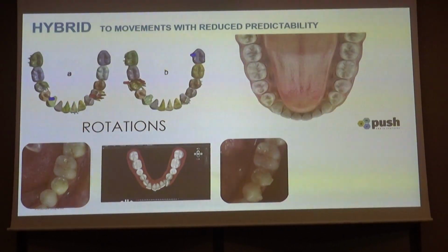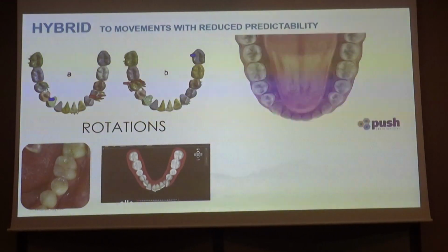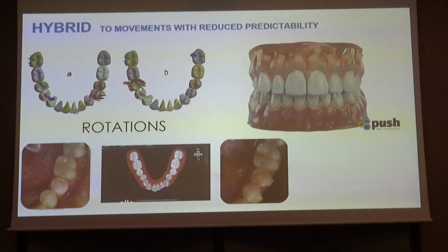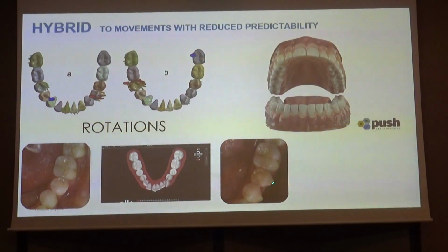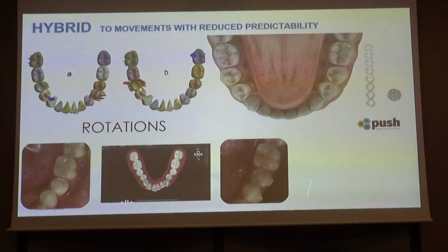Look, this is the mechanics. We did the hybrid mechanics here. Rồi, mọi người hãy xem cái sinh cơ học trong ca này thì mình sẽ làm hybrid. So we bonded the buttons in the buccal surface and in the lingual surface. Mình sẽ đặt button ở mặt ngoài và mặt trong. As you're seeing there.